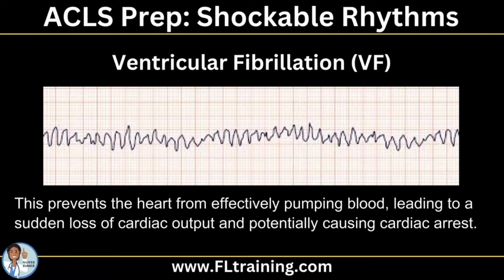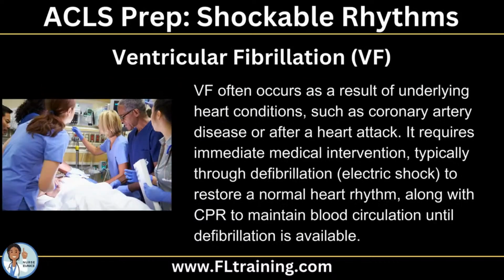So when you see this on the monitor, you're immediately thinking BLS. Is my patient responding? Do they have a pulse? Are they breathing? You want to be doing that assessment within 10 seconds and calling a code, calling for help if your patient's pulseless.